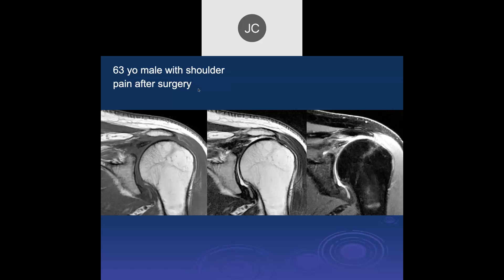It looks like a full thickness supraspinatus tear with retraction and severe migration of the humeral head.